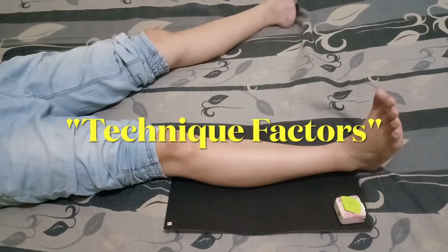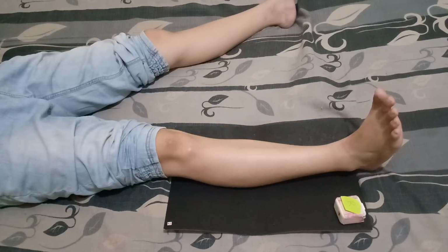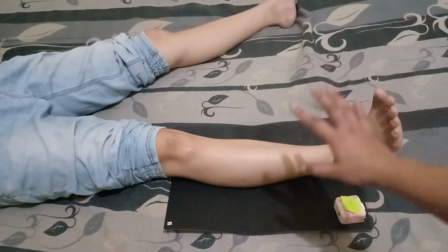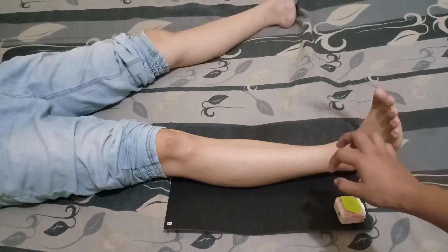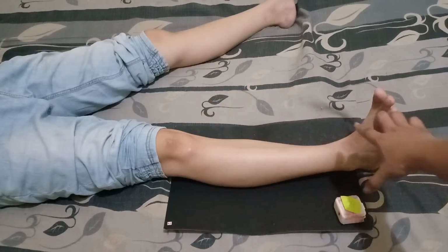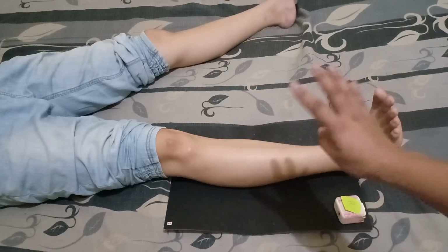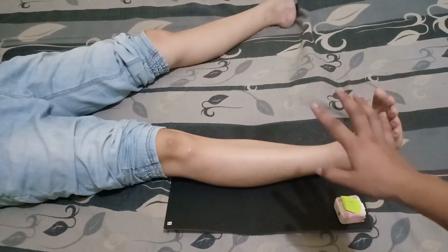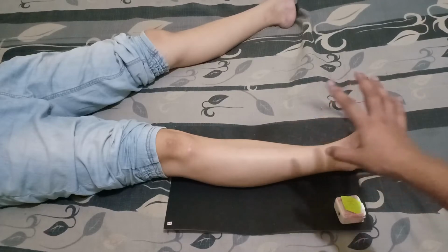For its technical factors, minimum SID should be 40 inches or 102 cm. It may increase to 44 to 48 inches or 112 to 123 cm to reduce divergence of the X-ray beam and to include more of the body part in this area. For its IR size, it should be 35 by 43 cm or 14 by 17 inches lengthwise or diagonal, which requires 44 inches or 112 cm minimum SID, non-grid, unless the lower leg measures more than 10 cm.